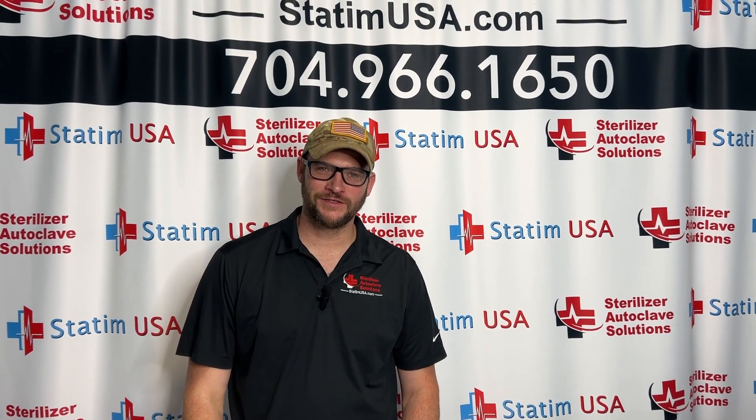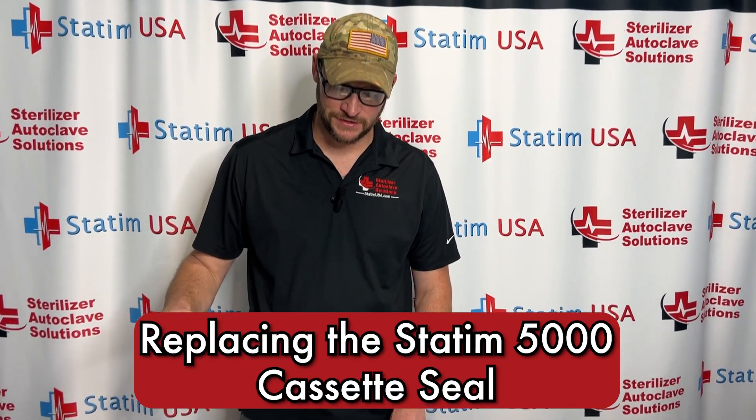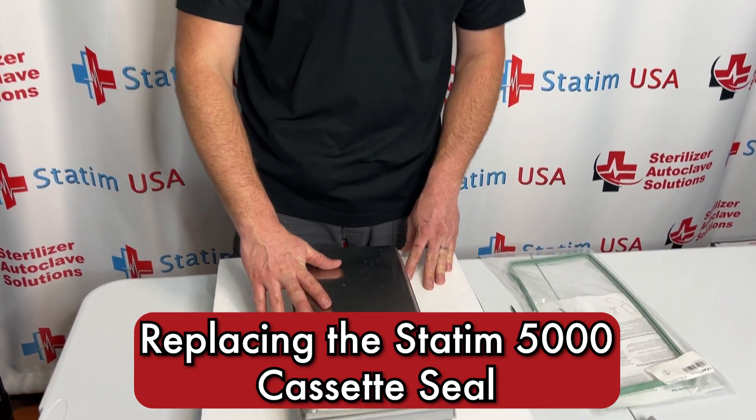Hi, this is Ian with Sterilizer Outer Clay Solutions. Today we are going to be changing the cassette seal in the STATUM 5000.